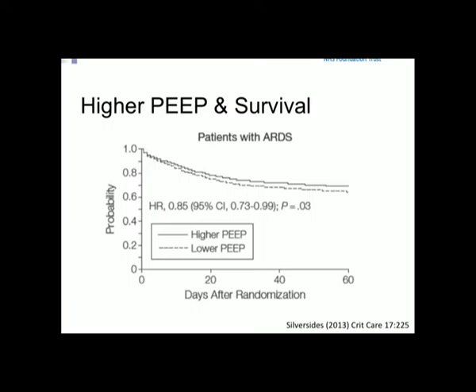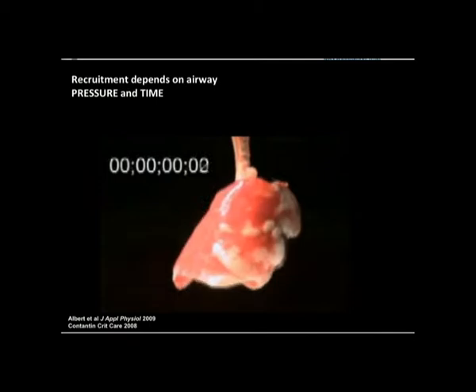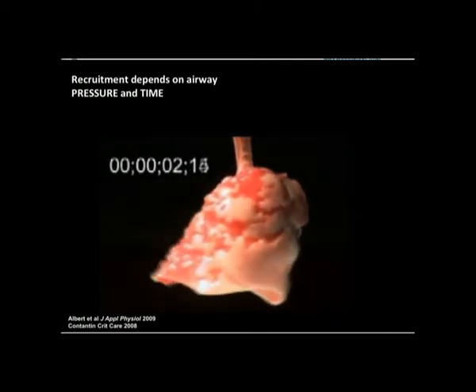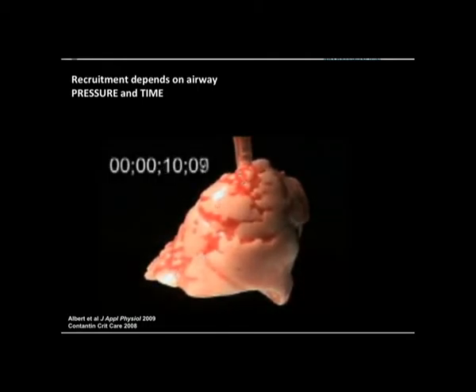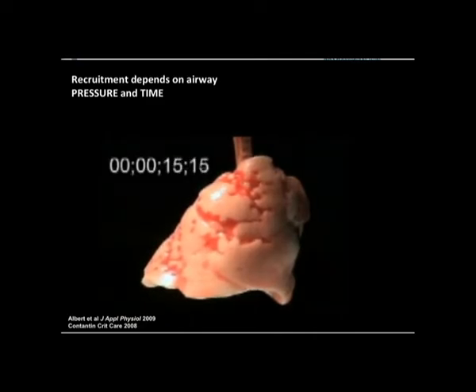We know that as PEEP goes up in our sickest cohort, it's associated with improved survival. We know that if we run patients at that higher level of PEEP, it's better. Setting PEEP can be difficult. Many people do a 40 by 40 centimetres of water for 40-second recruitment manoeuvre. And this is what a recruitment manoeuvre does. It opens up the alveoli. And you can see the way that you've gone from a completely collapsed lung, clearly not human, through to, by the time you get to the 40-second mark, progressive opening of alveoli.